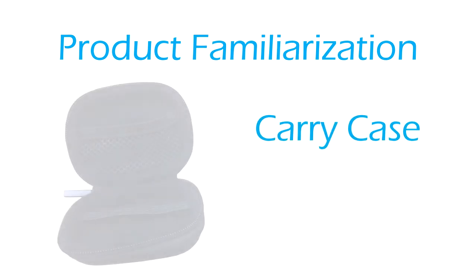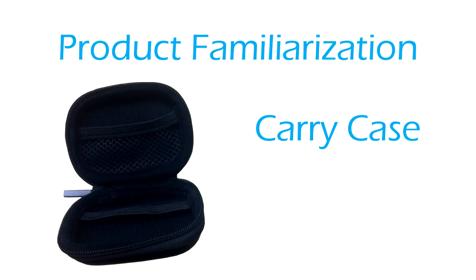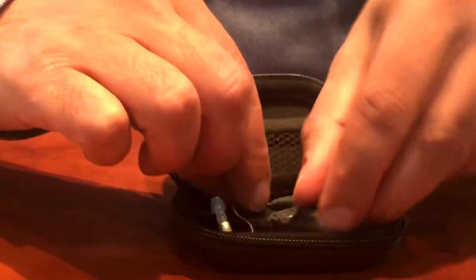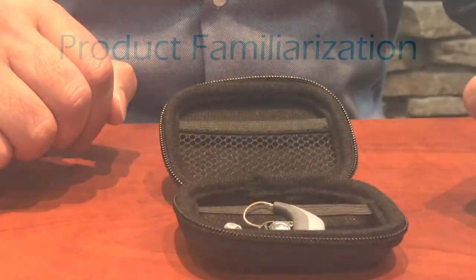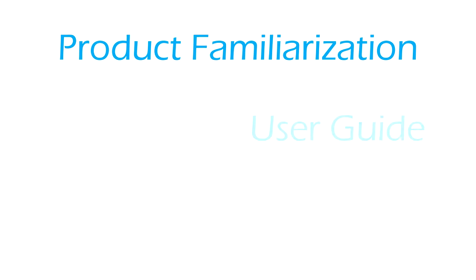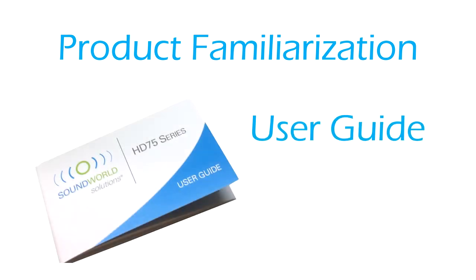Carry case: the carry case provides a protective compartment for storing the hearing device when not in use. Remember to open the battery door prior to placing the hearing device in the carry case. Cleaning tool: the cleaning tool can be used to carefully brush off earwax from the eartip. Holding the hearing device with the eartip facing down, brush off any earwax accumulation on the eartip. User guide: a user guide is included to refer to hearing device usage and maintenance.